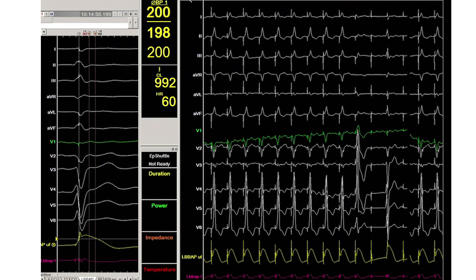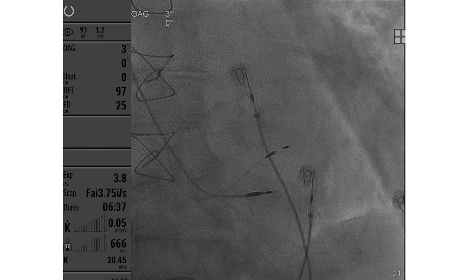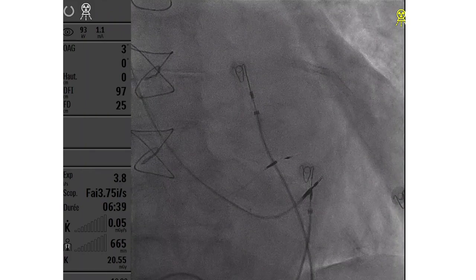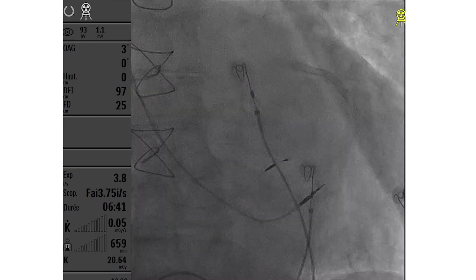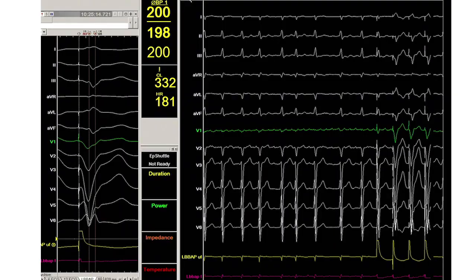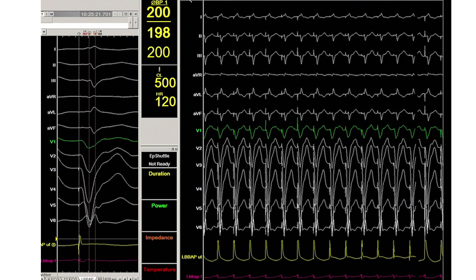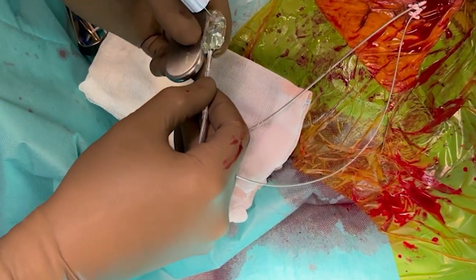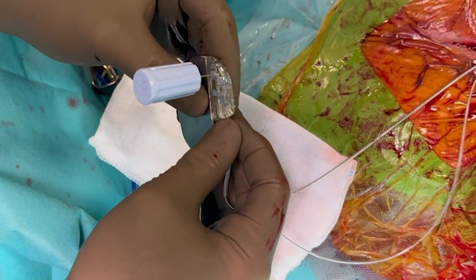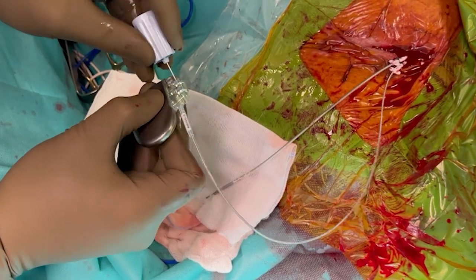There is ongoing discussion whether dependent patients need a backup RV pacing lead, since LBBAP can be considered experimental. In this case it was decided to place a standard RV pacing lead as backup in case of 3830 lead failure. Fluoroscopy shows that the standard RV pacing lead is clearly thicker than the 3830 and is placed more apically. The ECG shows how much wider the QRS complexes are when compared to LBBAP. In general, a LBBAP lead does not require special programming of the pacemaker. The RV backup lead may be connected to the atrial channel so the device can be switched to VVI after a few months, but guidelines recommend connecting it to the RV channel so that oversensing of the LBBAP lead does not inhibit pacing.